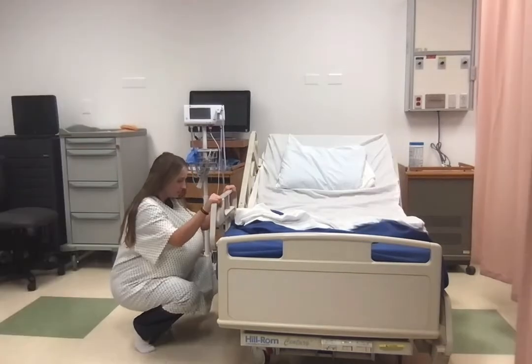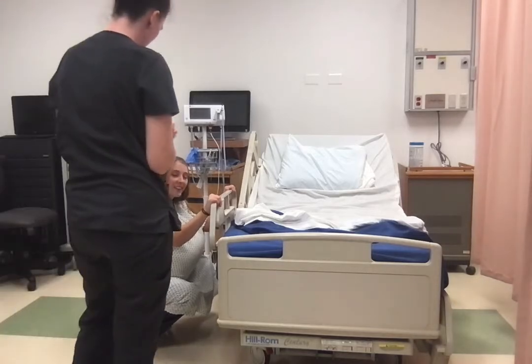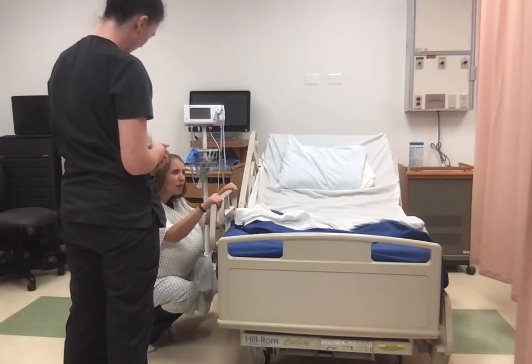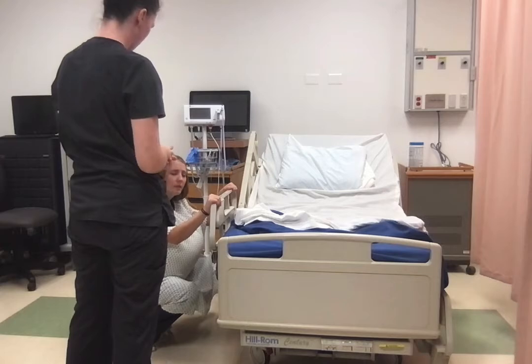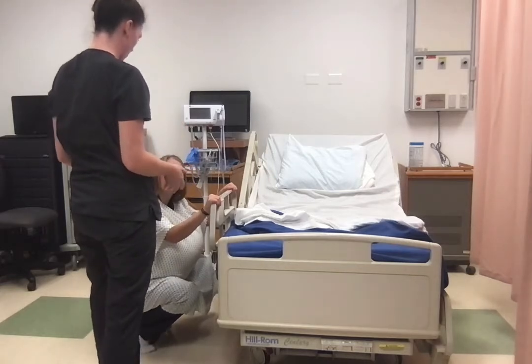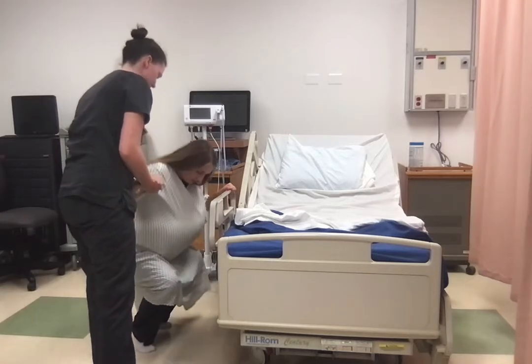Okay, great. After about 10 minutes, Nurse Lake enters the room after performing hand hygiene. Hi, Rebecca. Hi. How are you feeling? I'm still in pain, but it's, again, the pressure, it feels like I'm gaining more pressure. Perfect. Okay, so because you're feeling more pressure, I'm going to check your progress again. Okay. Let me help you back onto the bed.